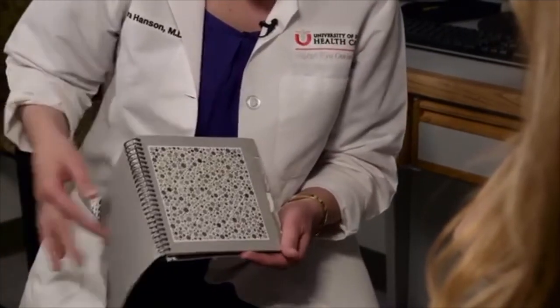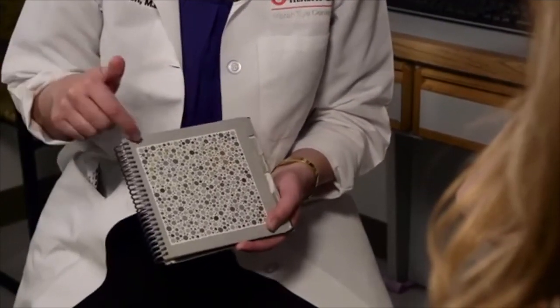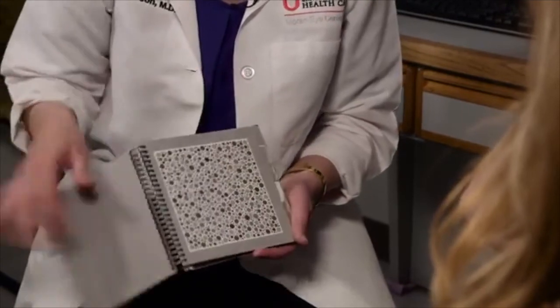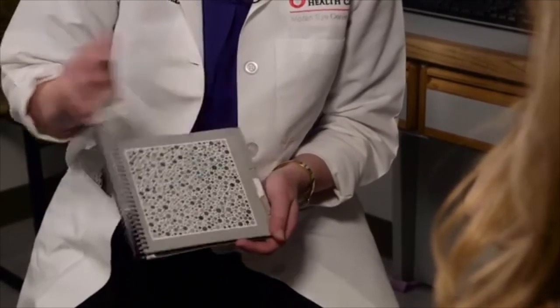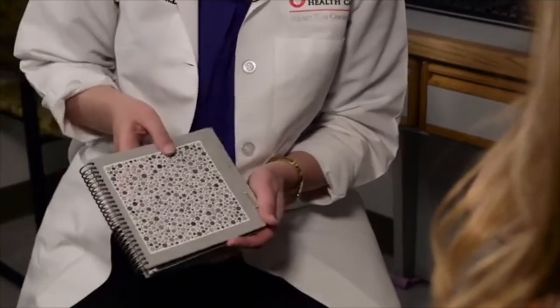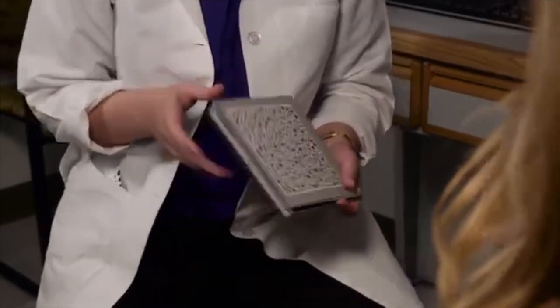And then the next 6 plates are the screening test. And so again, you have the patient test one eye at a time, ask them to go through each of the plates. O, X. Just a O. X, triangle. O, triangle. O. X. Very good. And then you can do the same thing with the other eye.